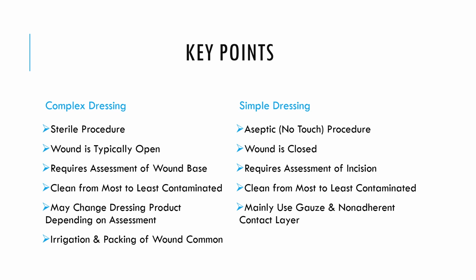There is a requirement that you need to do a wound bed assessment. You need to see what it looks like. Does it look pink, granulated? Is it black, or is there presence of slough? Whereas in a simple dressing, you only need to check how the incision looks, like if the edges are well approximated or not.